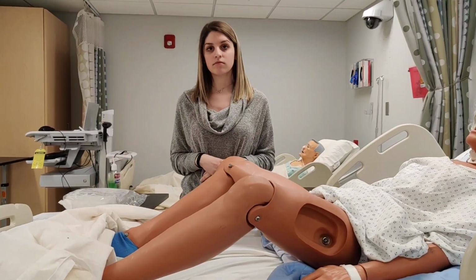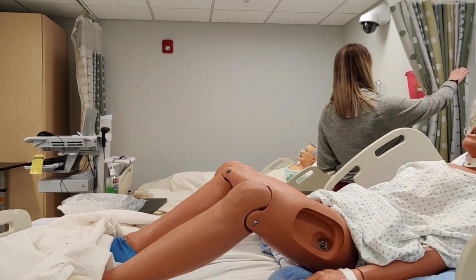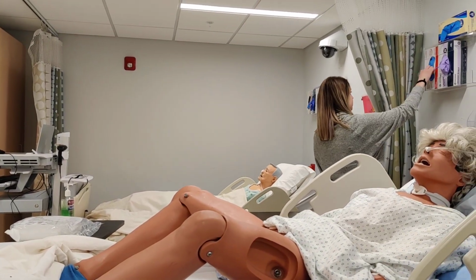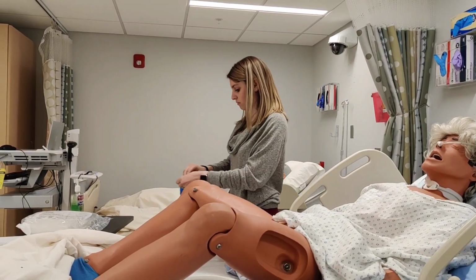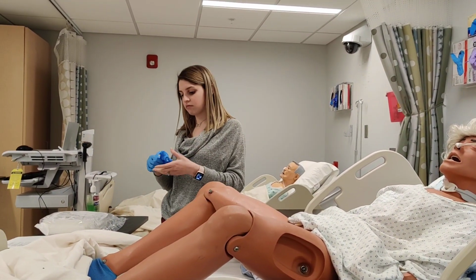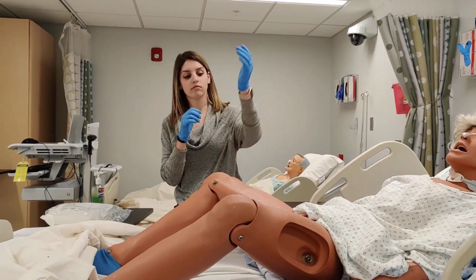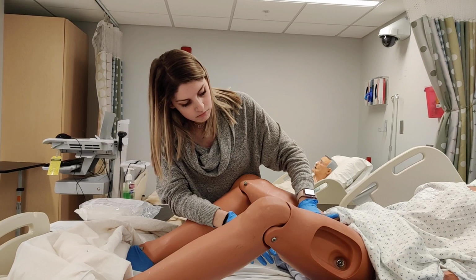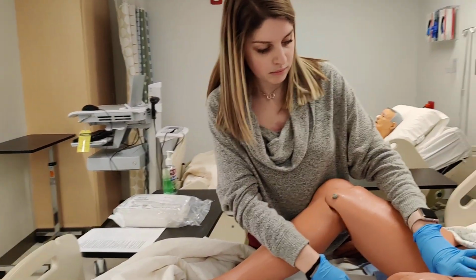Sometimes what helps is to have some clean gloves on. Once those are on, you can take a look to see where that urinary meatus is ahead of time. That way you have an idea of where you're actually going to place that catheter.